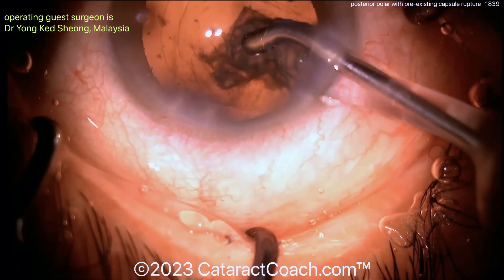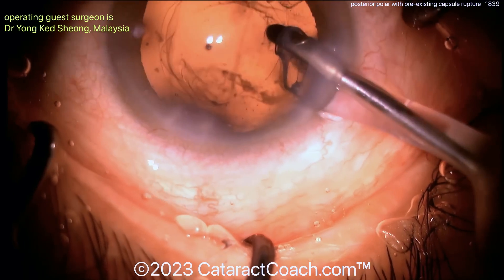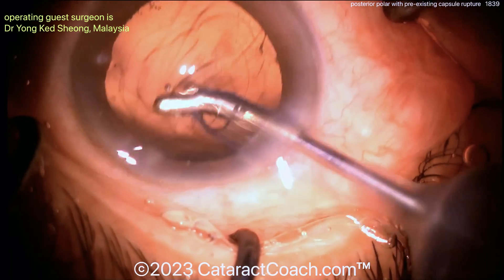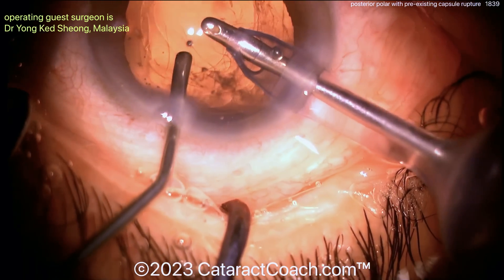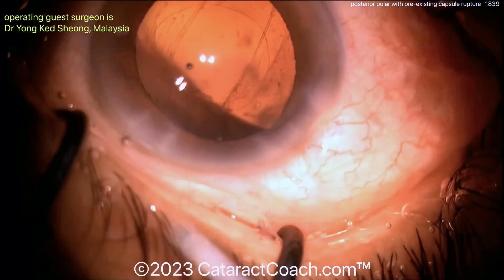Now going with the I&A probe to the sub-incisional area, getting that aspirated. You definitely want to use some triamcinolone in this case to stain any vitreous. If the anterior hyaloid face is intact, that would be fantastic. If it's not intact, you may have to do an anterior vitrectomy. In the case I posted a couple years ago on Cataract Coach, my posterior polar with a defect in the capsule, we did an anterior vitrectomy and the patient had a beautiful outcome.